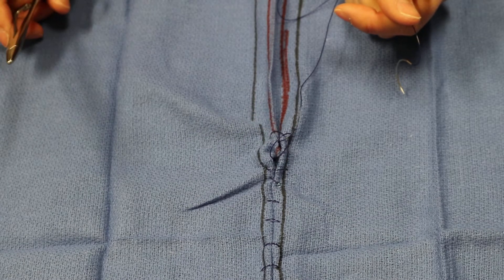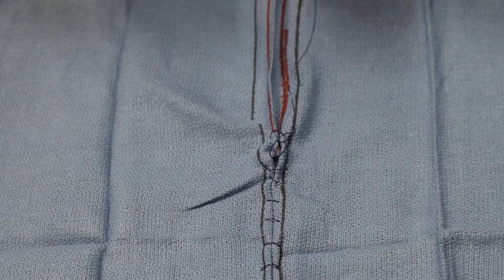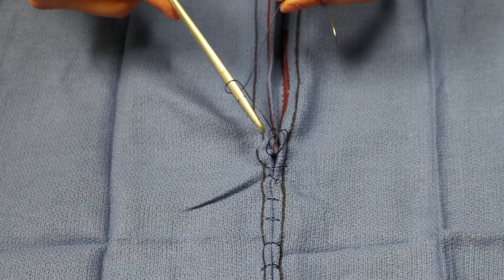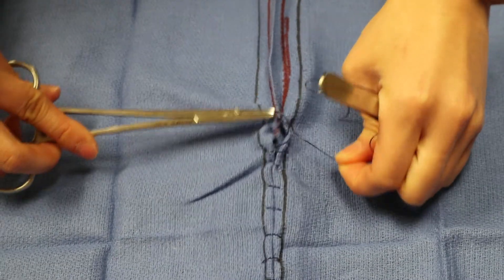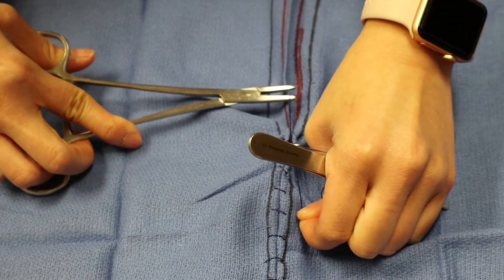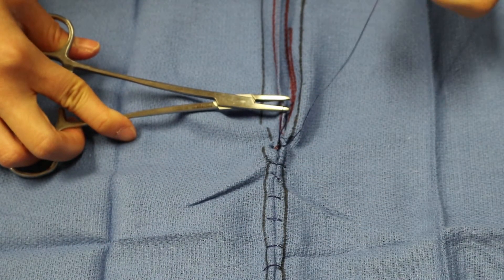It looks like that was a wide enough bite. So then you'll do four throws again. Usually you can get away with just a square knot throw unless it's under tension, then you can use a surgeon's knot, and you're going to pull up and down with the incision and that's going to help it drop into the pocket that you just created.